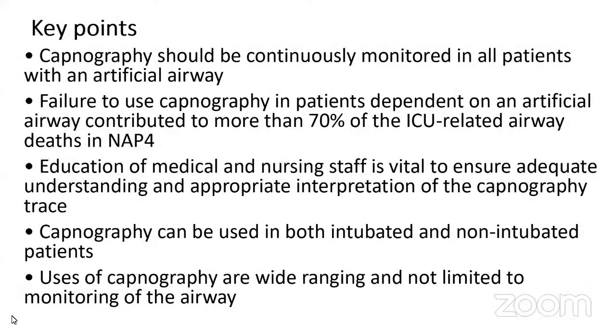The main key points here are it should be continuously monitored in all the patients with an artificial airway. Failure to use capnography in patients dependent on an artificial airway contributed to more than 70% of the ICU related airway deaths in the guidelines of the 4th National Audit Program.